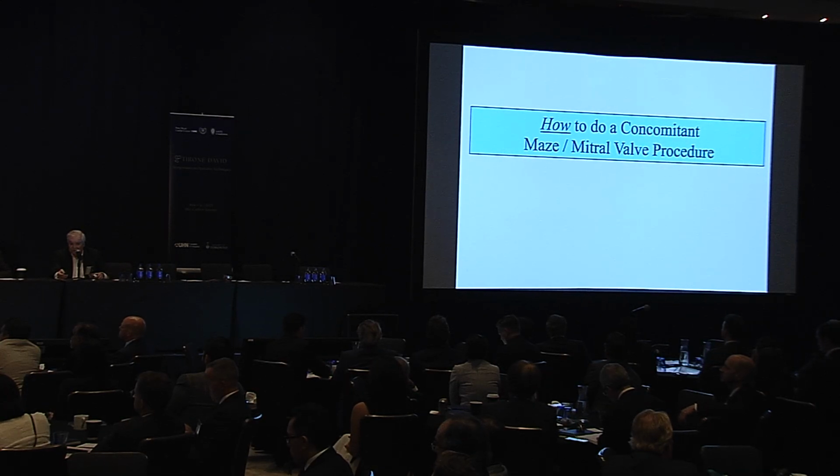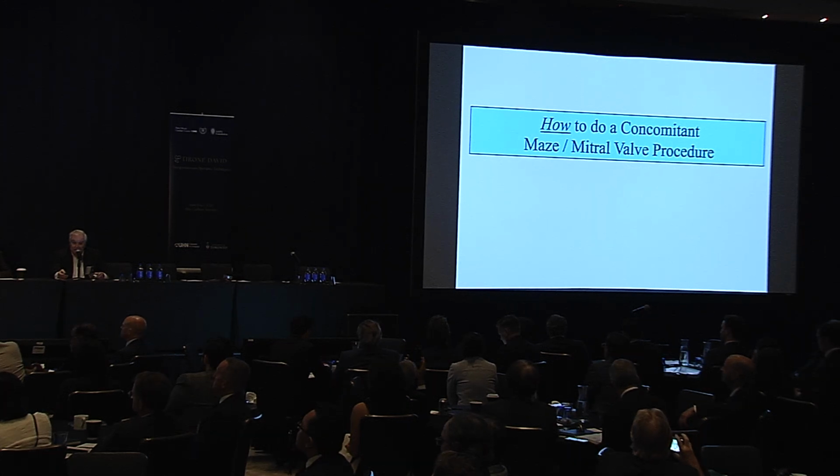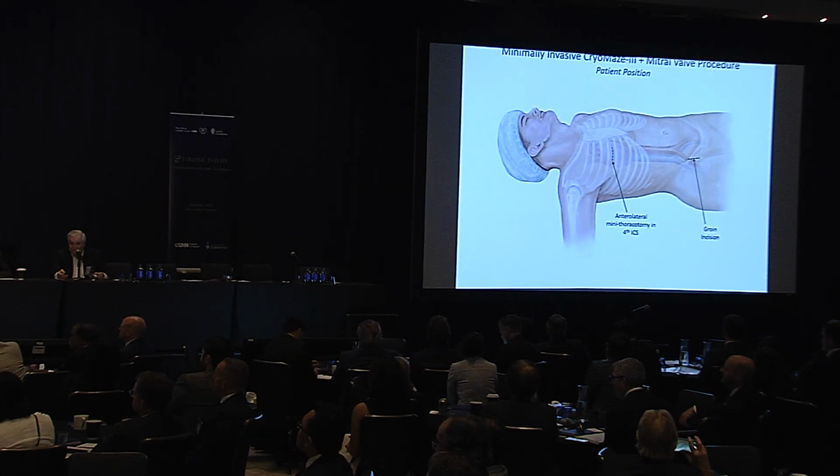What about how to do a concomitant maze? Well, we could maze mitral valve. We could spend a long time on this, but I'm going to spend about 2 minutes on it.